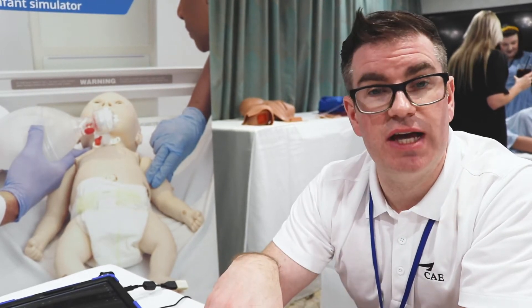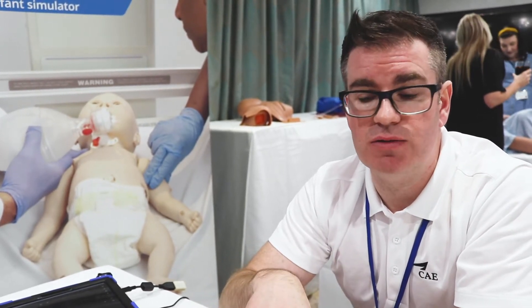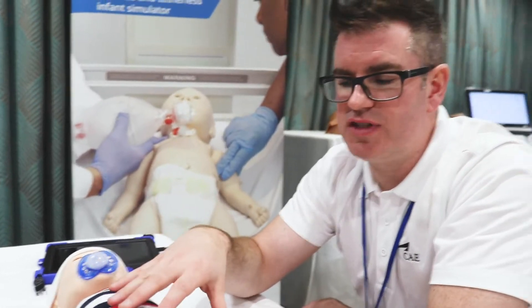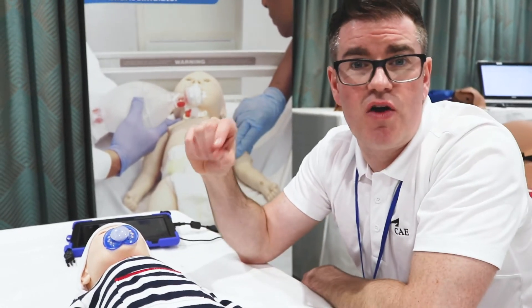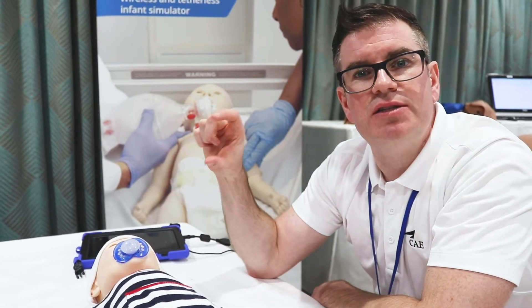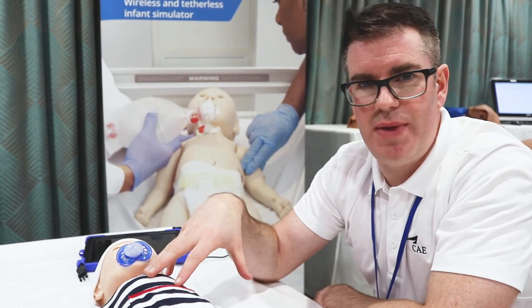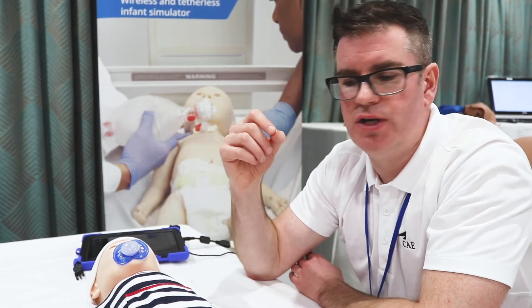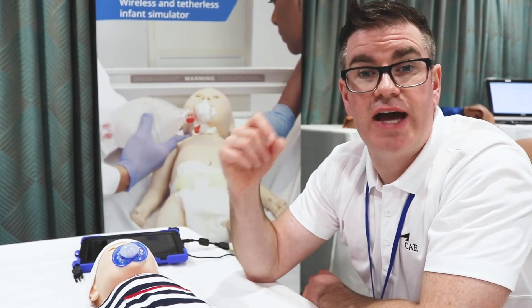Luna has heart sounds, lung sounds, and bowel sounds using the new Stethosim technology. Unlike other simulators which have speakers under the chest, Luna has RFID tags. The sound comes from an adapter that you attach to the stethoscope rather than the mannequin, which improves the quality of the sound, making it a lot more realistic for candidates in the scenario.